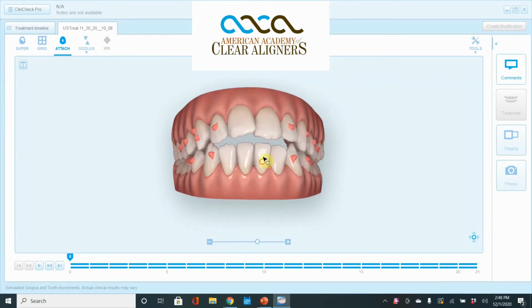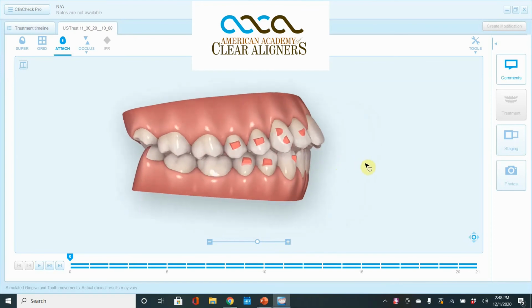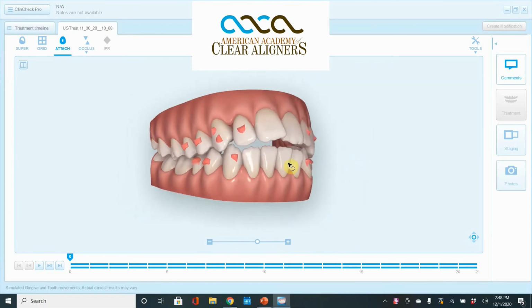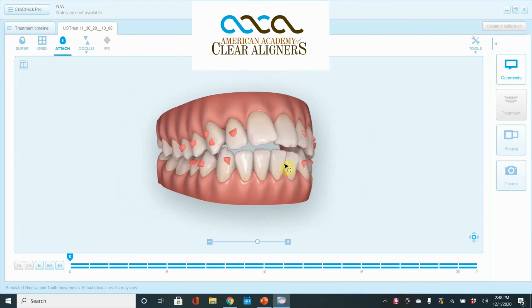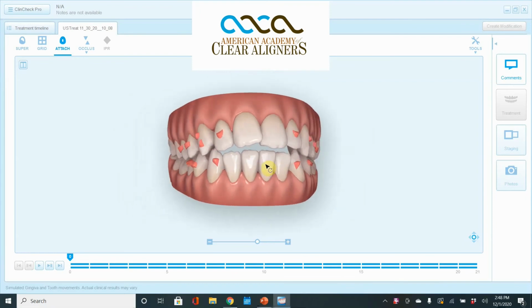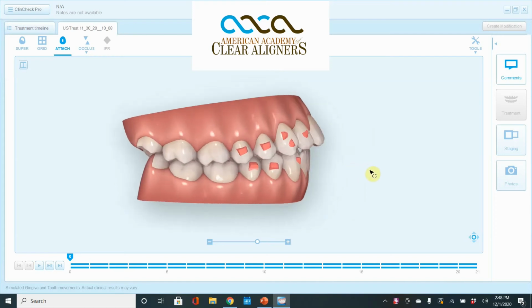Today we're featuring an anterior open bite that is almost perfectly set up. It's got a nice class 1-ish occlusion with a flare. Most likely this person is a thumb sucker or has some sort of digit habit, maybe a slight upper tongue thrust. What we want to do is use relative extrusion first to get rid of the flare.